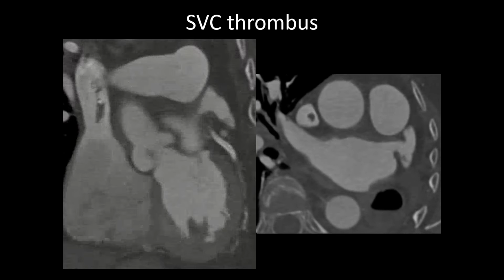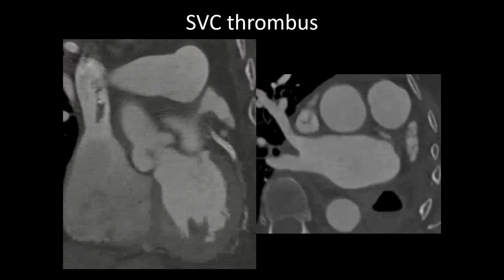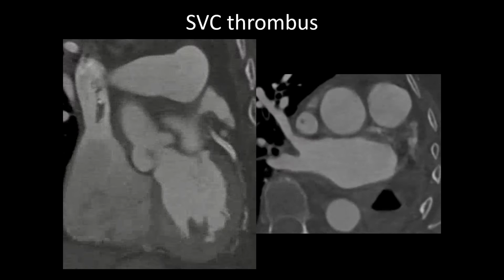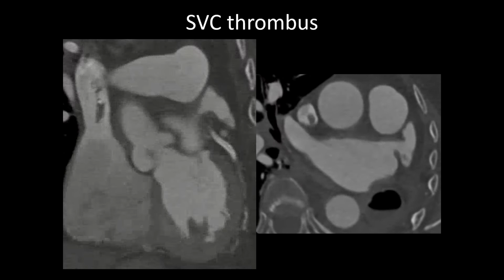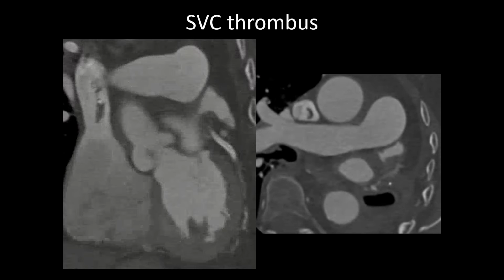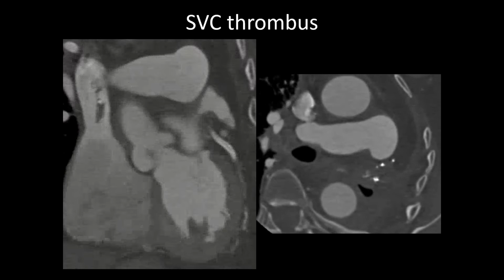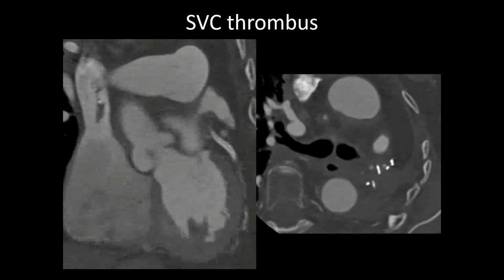I think she's had a PET not too long ago, as well as multiple chest CTs, and she was evaluated by hematology oncology, who do not feel that she's had recurrence, and that these thrombotic events were probably old thrombus. She did have a jugular venous thrombus that we were told resolved, but I think that whole innominate vein is thrombosed.